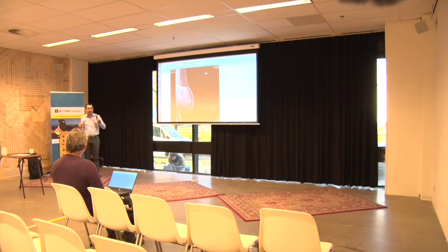For those of you who are actually trying to install Micro DICOM, usually that pane is small, so you may want to stretch it out a little bit to be able to see. But again, this is one of the reasons why DICOM is good with imaging, because you see all this metadata that allows us to get more information about the image, the study, the patient, all in one place. So less chance of misplacement, less chance of things going wrong.